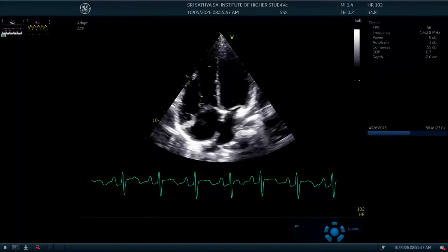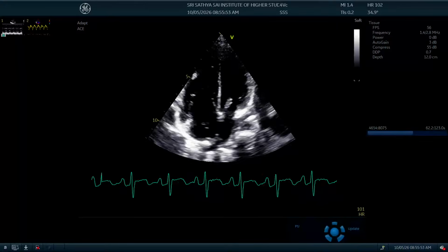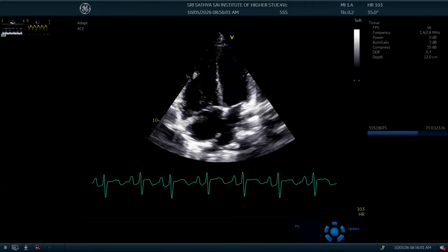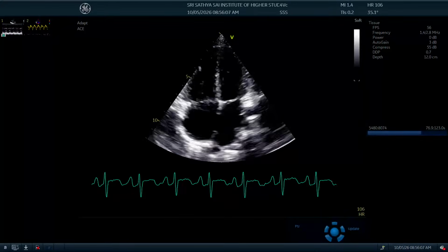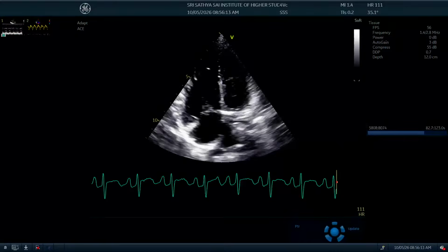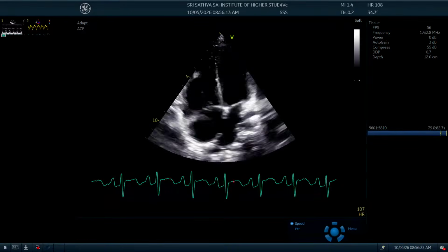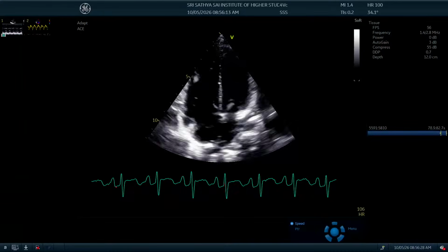There are other things that you can make out in this. All these are subtleties. You see, there is a deep S in that ECG. It's probably lead 2, right? It's lead 2. S in lead 2 is not common. That means there's an RBBB in this patient. Why is there an S in a left-sided lead? Lead 2 is towards the left. It's 1, 2, 3, right? So probably you have an RBBB there. All these things should come to you when you're doing the echo. I'm not saying this is an echo class. Imagine again, this is a human being. You need to see all of that. Is there an RBBB on the ECG? See it later. I'm talking of lead 2 showing an S. Why is lead 2 showing an S? Integrate your echo and ECG. That's all I'm trying to tell you.